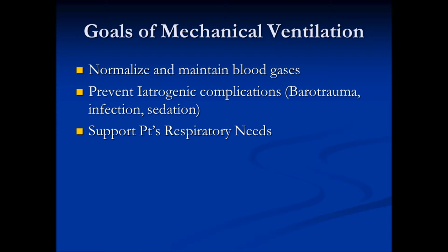from occurring. And then if a patient, for whatever reason, cannot maintain their own airway or is not breathing adequately, so they don't need to necessarily be apneic, but if their respiratory system needs to be supported, which kind of goes back to the first bullet, because that would be represented in your blood gas values by a patient who is in impending ventilatory failure or in respiratory failure.